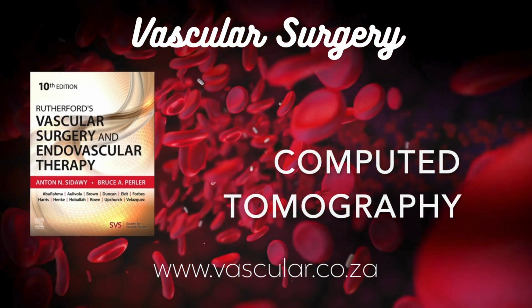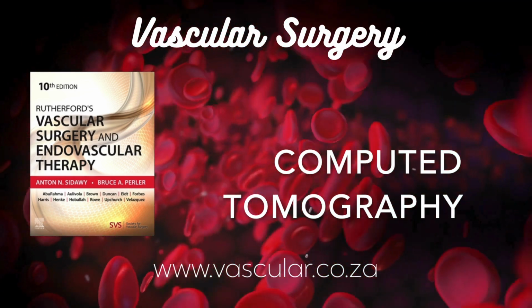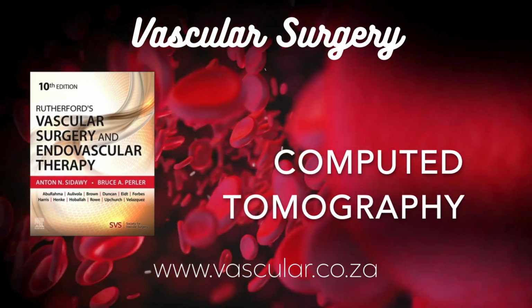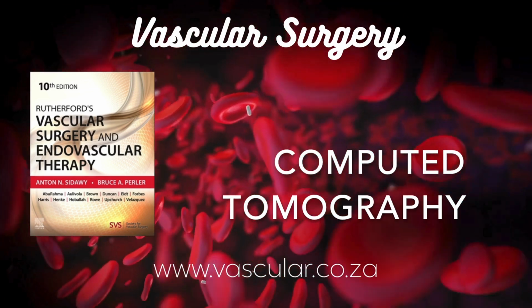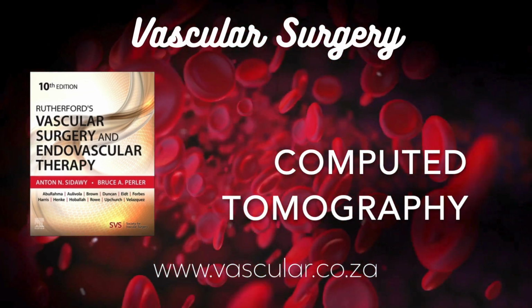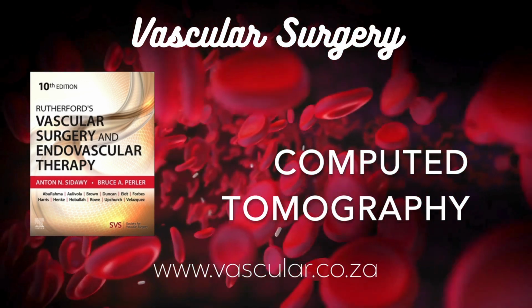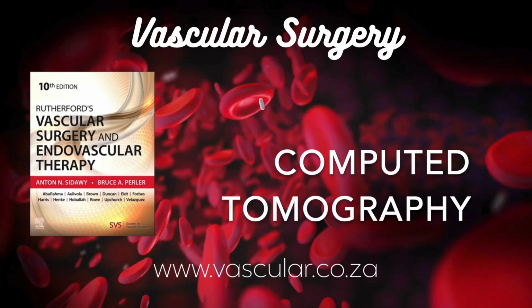Any downsides to IR? The main historical downside was computational time. It just took a lot longer to reconstruct images. But with modern computing power, that's much less of an issue. The images can also sometimes look a little different, maybe slightly blotchy or waxy compared to FBP, which radiologists had to get used to. The newest algorithms are even fully model-based, getting even better results. Amazing progress. Yeah. Okay, what about dynamic and gated scanning?